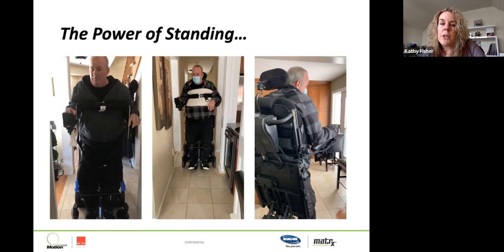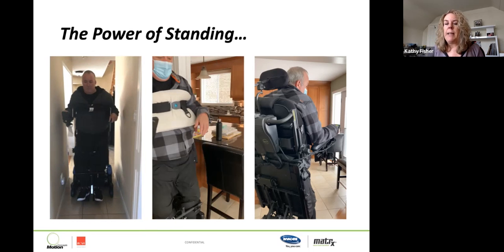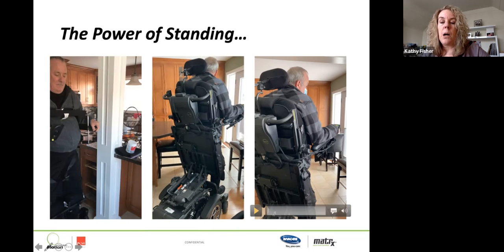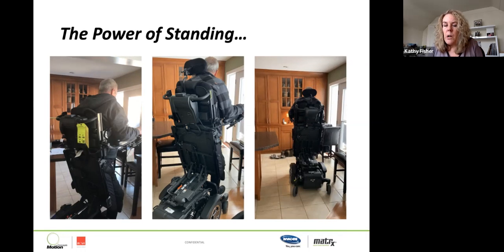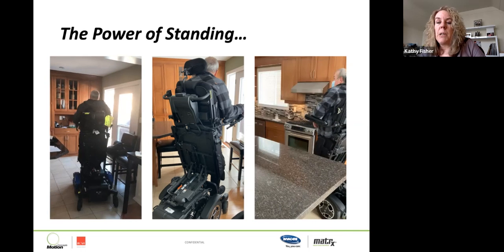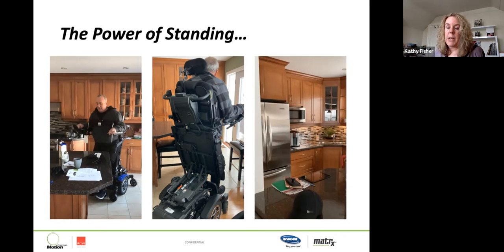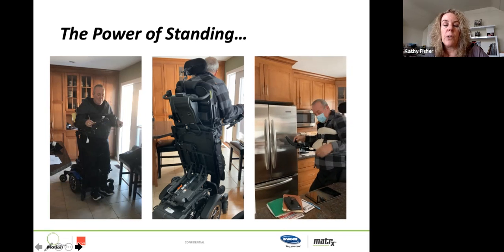And you can see one of the challenges for him has been getting him in a better position, getting him more upright. He really hangs on the chest strap, and he's very sensitive through his chest. He was getting a lot of pain. So our plan is that we're going to do a custom posture flex belt that has padding built into it. But from a stability point of view, he's still more comfortable with an actual seat belt to hold him in. So again, what he said to me is, this has been a godsend because I've been able to stand when I couldn't have people in my home. I wouldn't have been able to do outpatient therapy because all of that has been canceled for the last almost 2 years. So he didn't have access to that. If he hadn't had the stander, he would have lost 2 years.